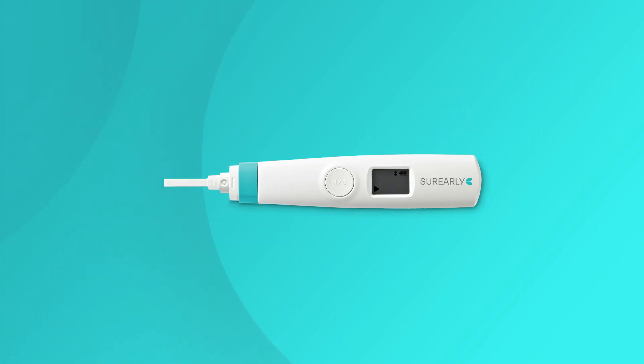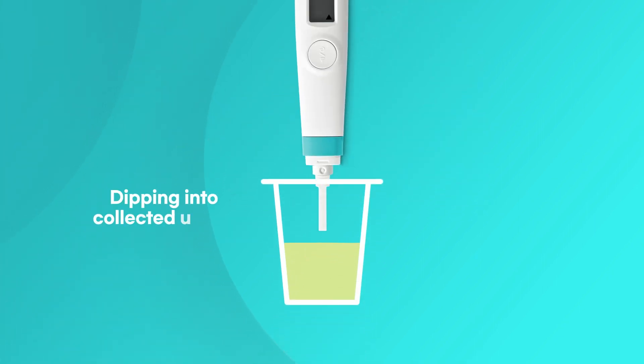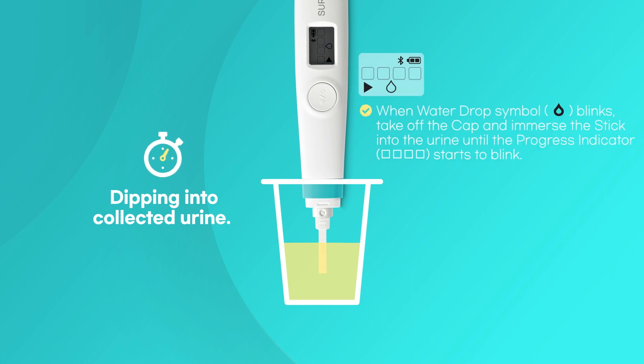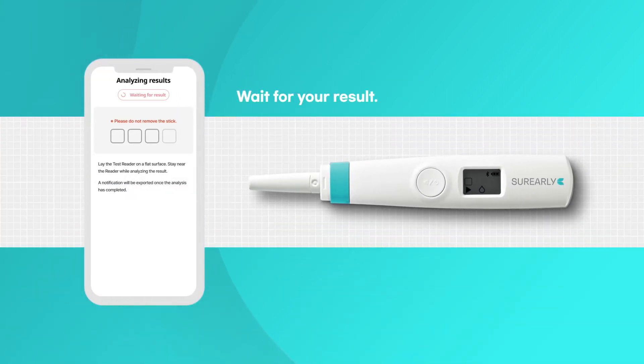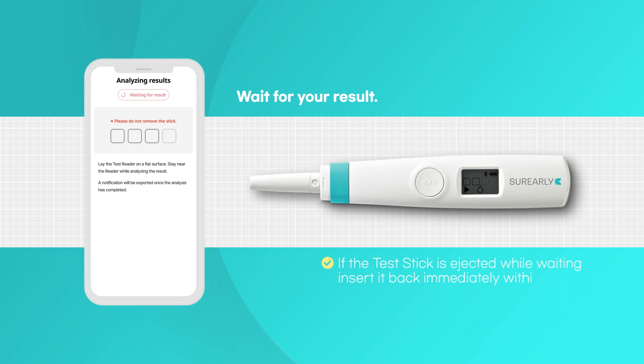Soak more than half of the absorbent tip in the urine for about 10 to 15 seconds until the progress indicator starts to blink. Place the test reader on a flat surface and wait for your result.